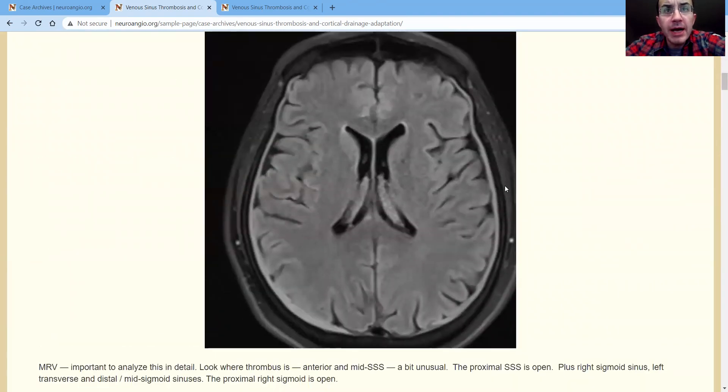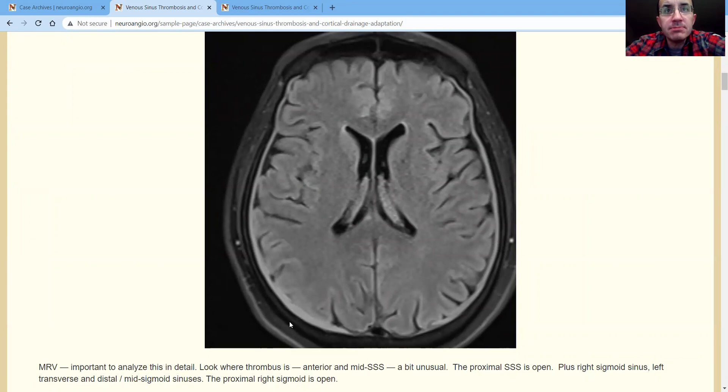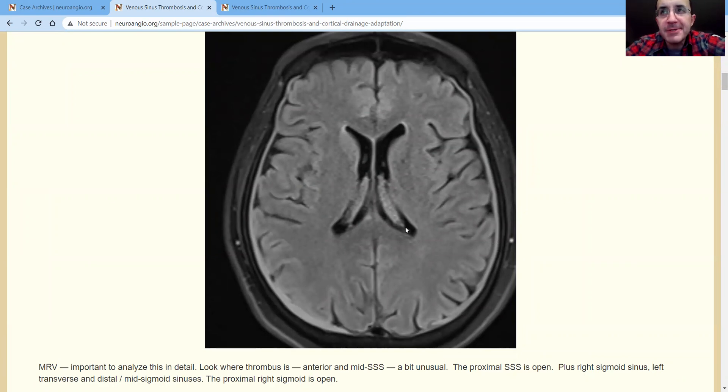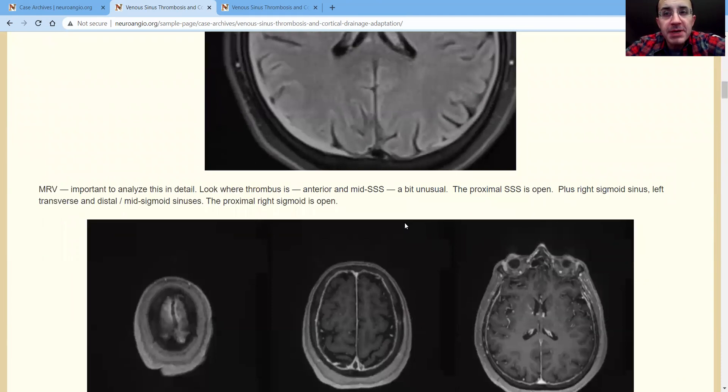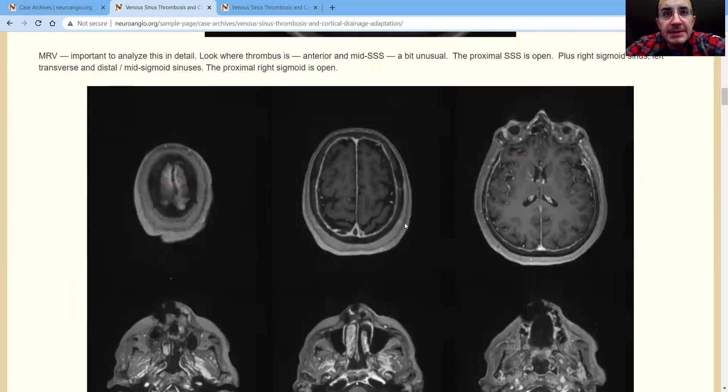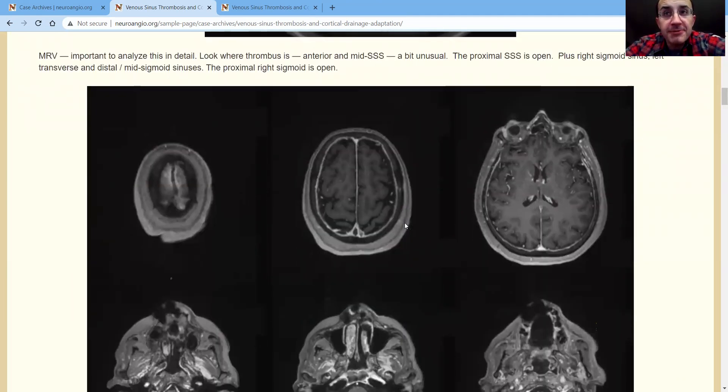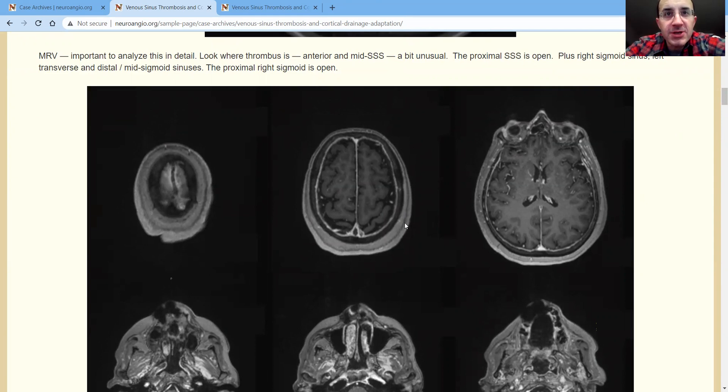Here's the MRI. Again, the rest of the parenchyma is okay. There's no hemorrhage, infarction, anything. She's doing fine from that perspective. Here's the MRV. It's a contrast MRV, or you could just do a volumetric MR post-contrast. That works great too.